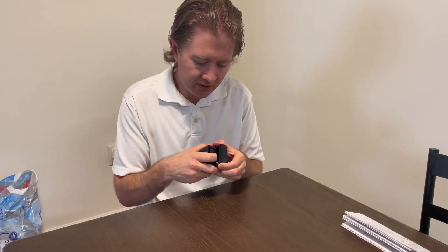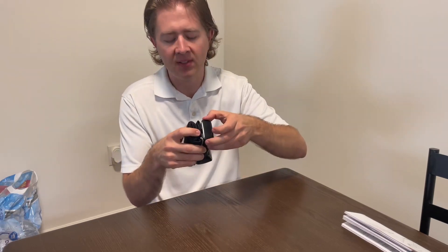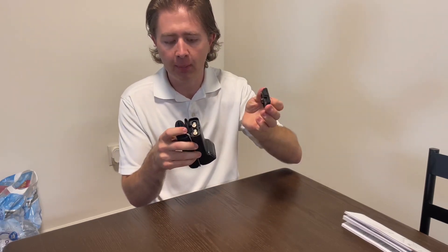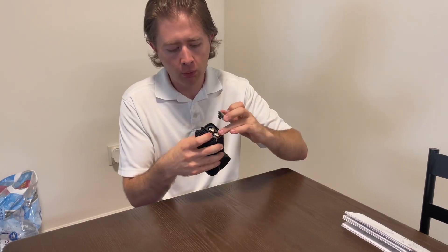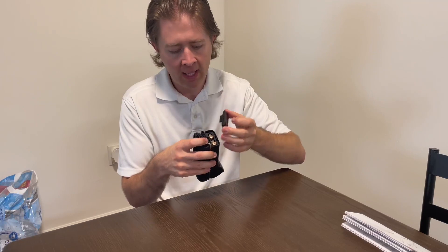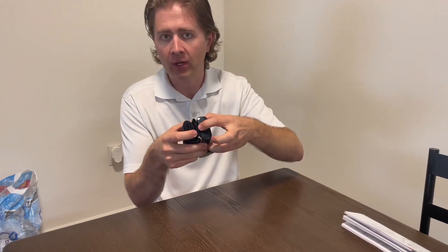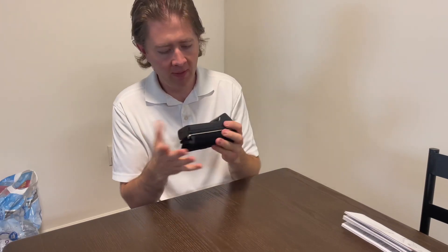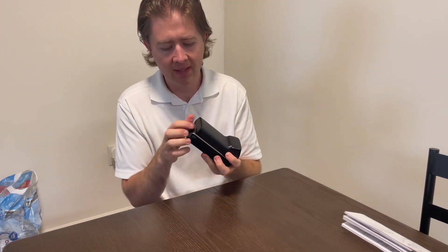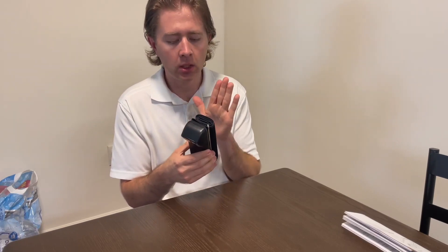When you pull this back, it's down there in the center. When you press that, that releases and this just pops off. You've got four AAA batteries right here — each one goes in a different direction. Then you just pop that back on and you'll hear it click. It's pretty easy to change the batteries, and it's got a cuff that you cannot take off.